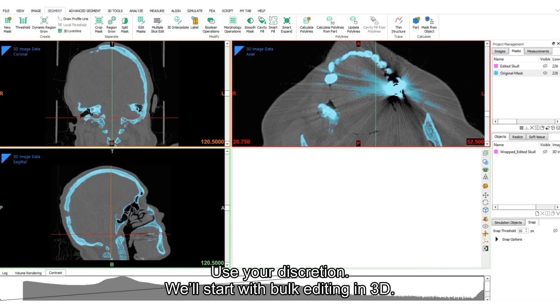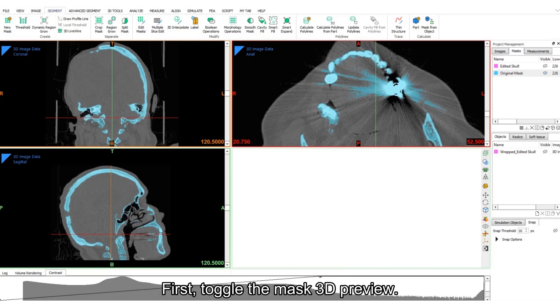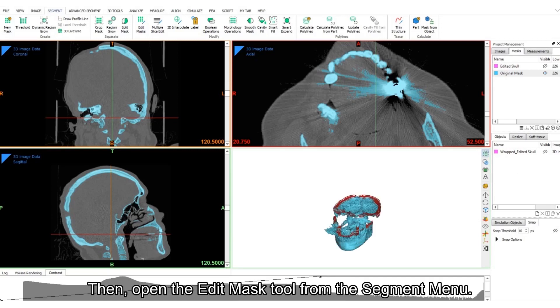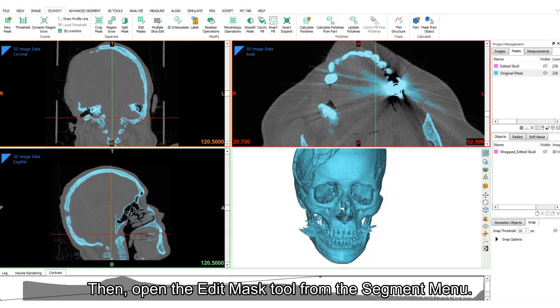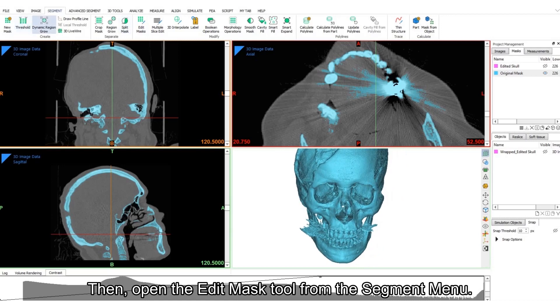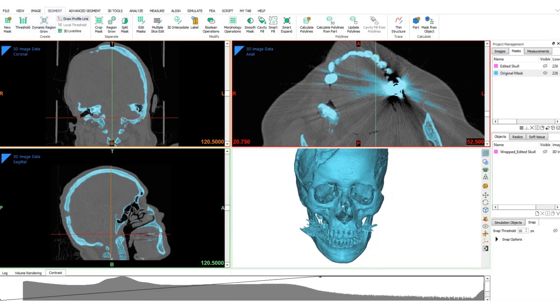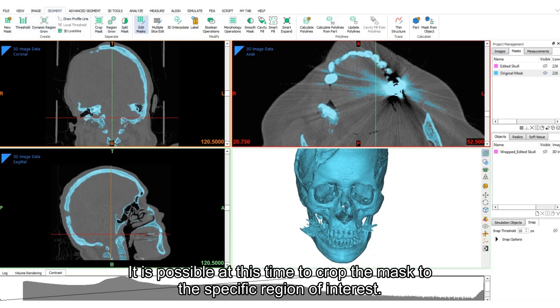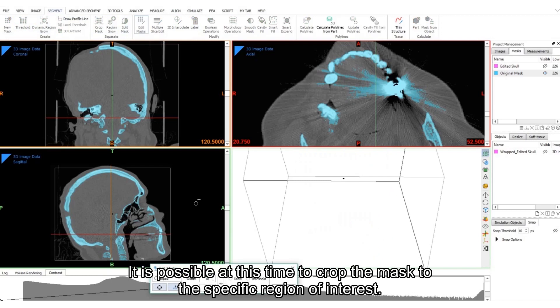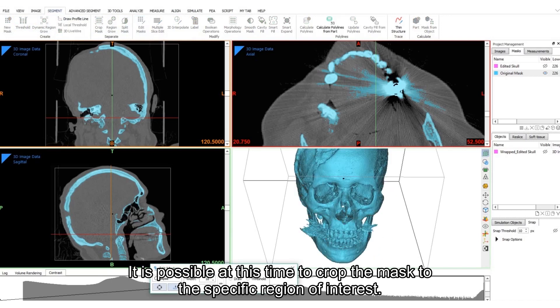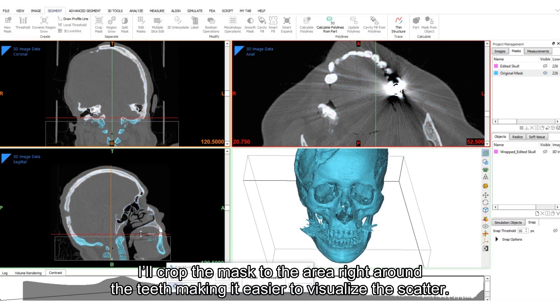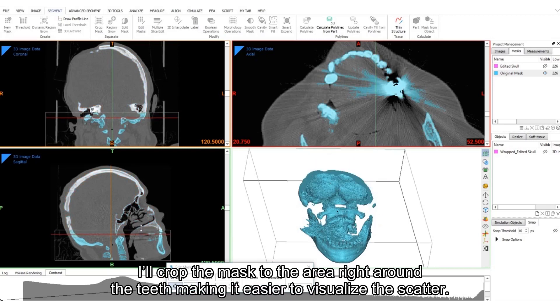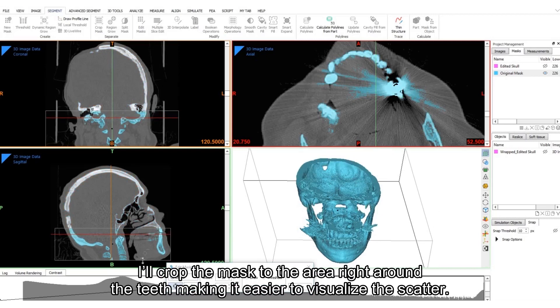We'll start with bulk editing in 3D. First, toggle the mask 3D preview. Then, open the Edit Mask tool from the Segments menu. It is possible at this time to crop the mask to the specific region of interest. I'll crop the mask to the area right around the teeth, making it easier to visualize the scatter.